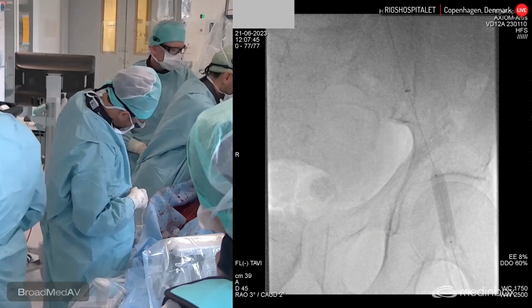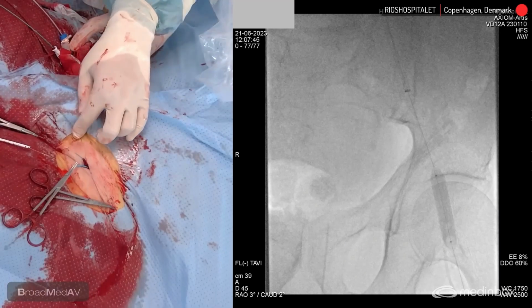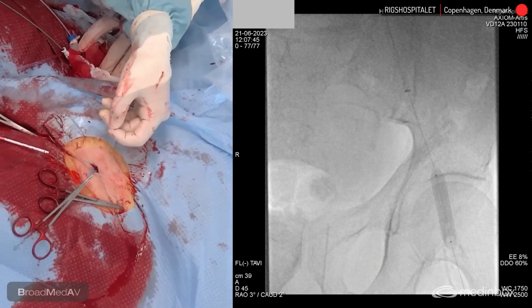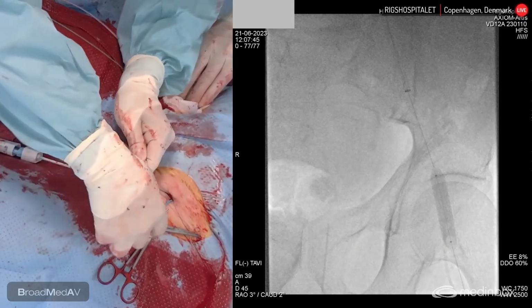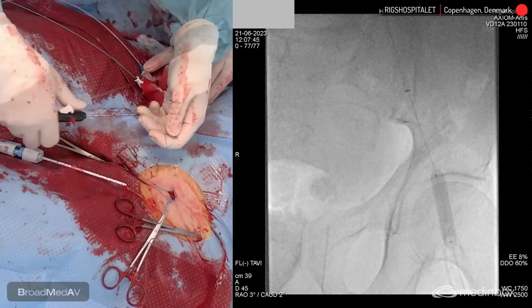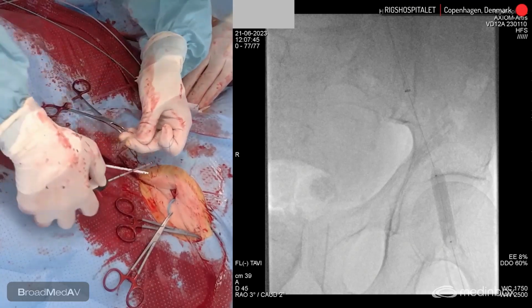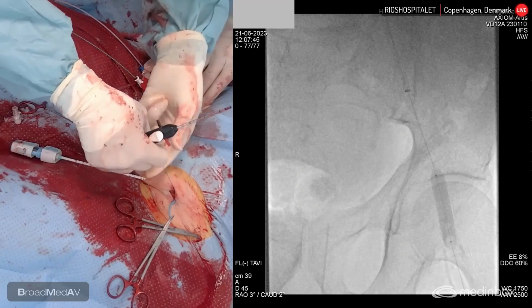And then I think this one, we're going to need 2 extra ProStyles and 1 Angio-Seal. Or do we do just the 8 with the Angio-Seal and the other with the ProStyle and Angio-Seal? We can do that. No, it's going to be easier: 1 ProStyle and 2 Angio-Seals.